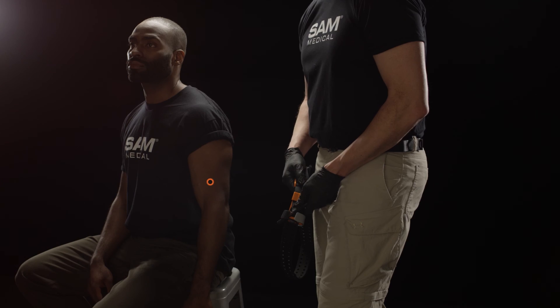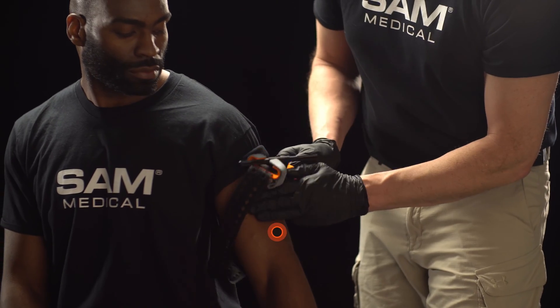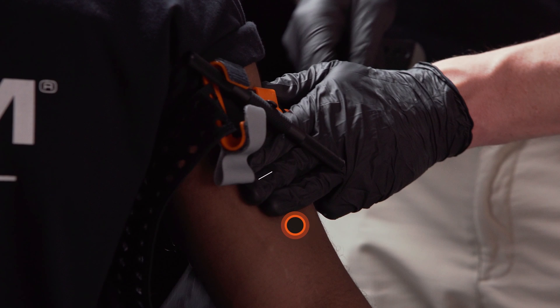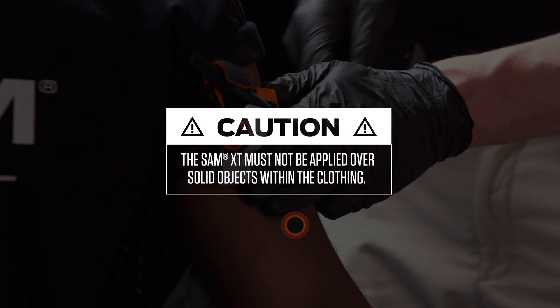To begin, locate the site of the injury. Position SAM XT directly onto the skin, about 2-3 inches above the wound. If applied over a garment, be sure to remove any solid objects on or inside the clothing.